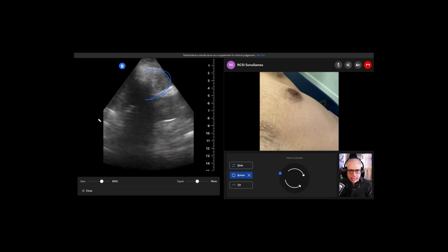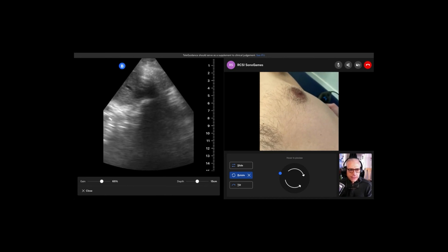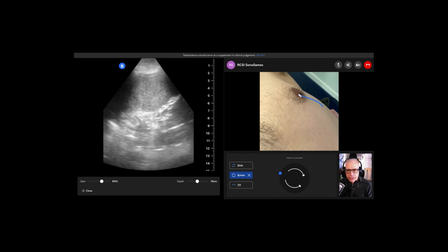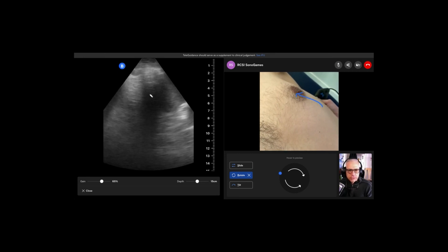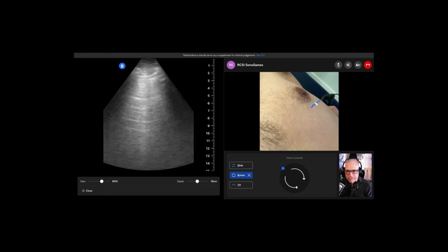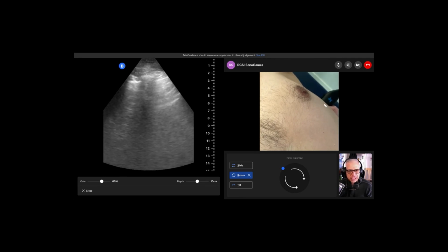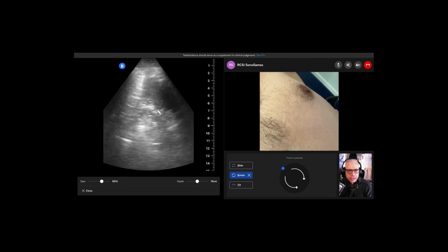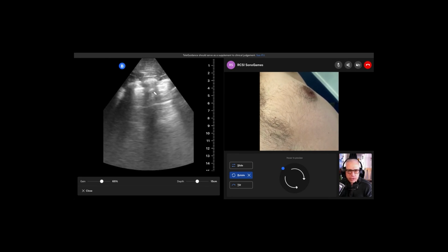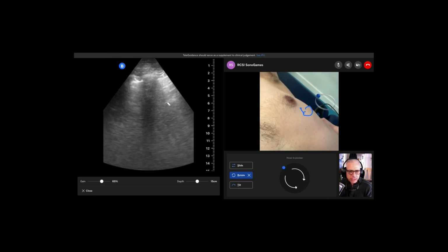So you want to get superior. So you have to slide north, slide to the head. Keep going. Keep going. So you want to go this way. It's not too far. There's lung. So now you want to just really fan back and forth and see if you can get rid of the lung and just see that spleen. So typically it's going to be really low towards the bed. Right there. And maybe try and slide down one, right around here is where you should be, probably.